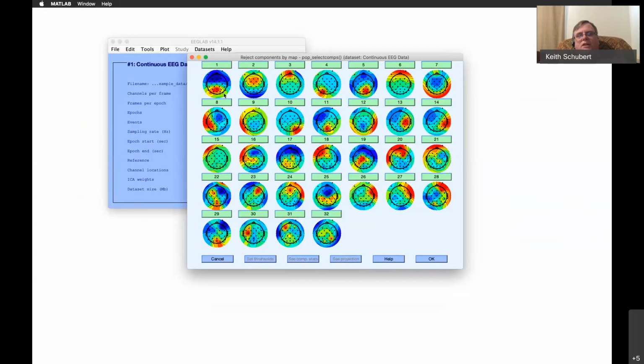When you see a big thing in the back, this is definitely processing the images that it's noticing. This is probably blink, just given it's right in the center. A single one right in that prefrontal cortex. So this is probably actually the blink response on somebody. This, like I said, is probably hitting a lot of the muscle planning areas. Recognition and classification ones are happening on either side here. This one, I am kind of questioning too.